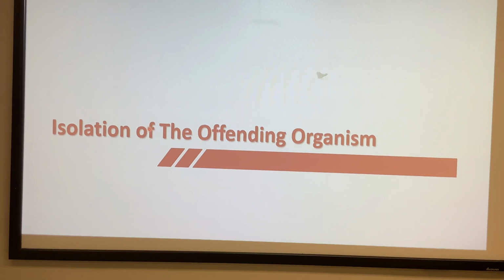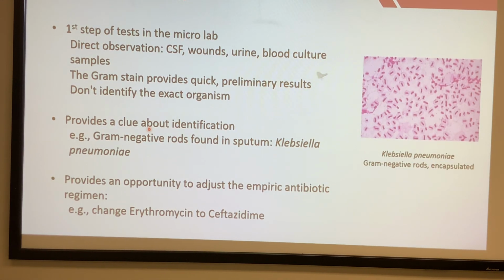Okay, so talking about direct observation, we know for sure what we see. I forgot to ask you one question about gram stain. Tell me if you think it's necessary to do a gram stain on a stool sample. If you receive a stool sample from a diarrhea patient, are you going to do a gram stain on the sample? No? Why? Yes? Why? Give me an explanation.